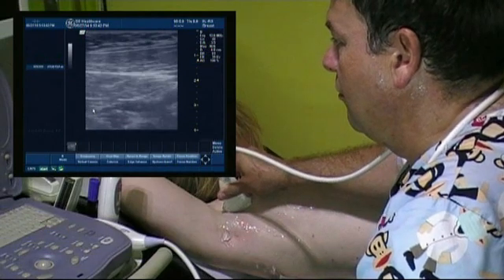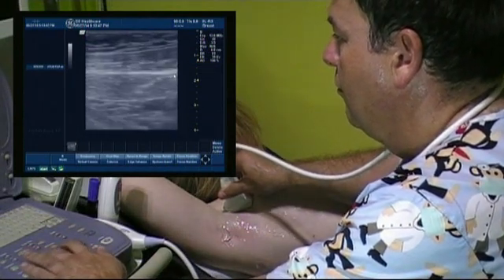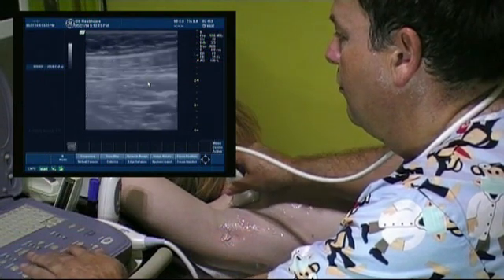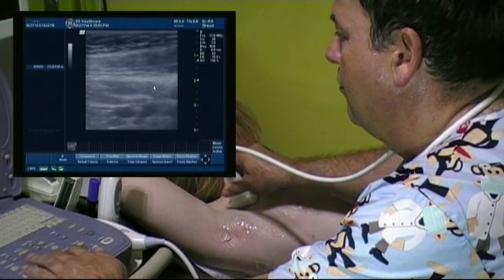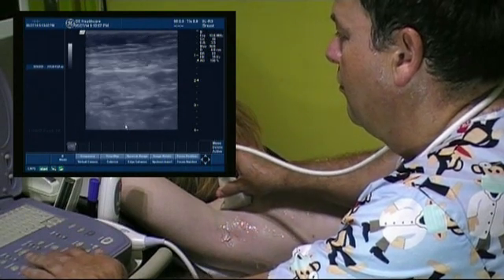Then we move medially to scan level 2. We locate the pectoralis minor, a small narrow muscle below the pectoralis major, and we scan the area under the muscle, level 2, and medially to its edge, level 3.